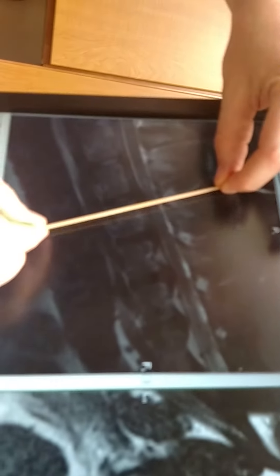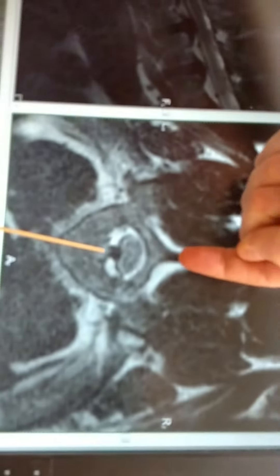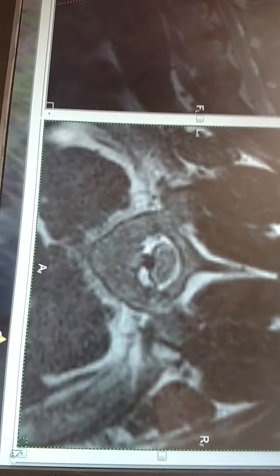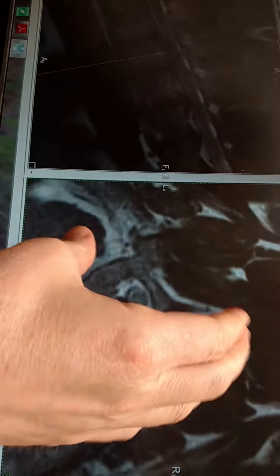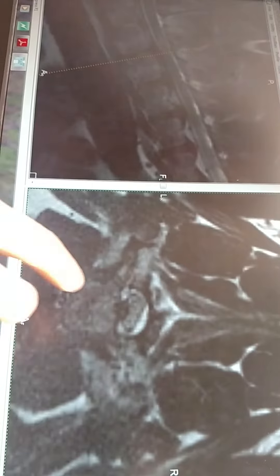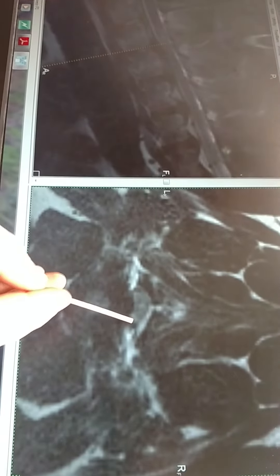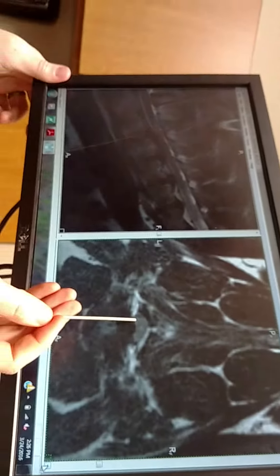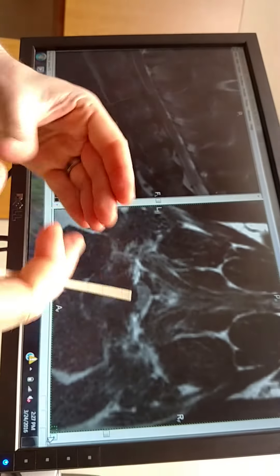As I move this orange line up into the problematic area, watch how the spinal cord gets compressed at that side. We're going north — from his chest into his neck, toward the ceiling, toward the head. Watch how the spinal cord gets compressed here. Watch how the fat disappears as we move to that area. This is going to get larger... and there it's gone. So what's happening is the disc underneath is herniating upward into the spinal canal, flattening the spinal cord into a pancake sort of shape.